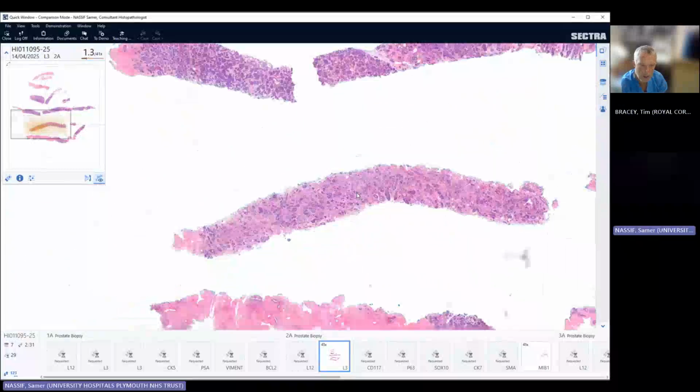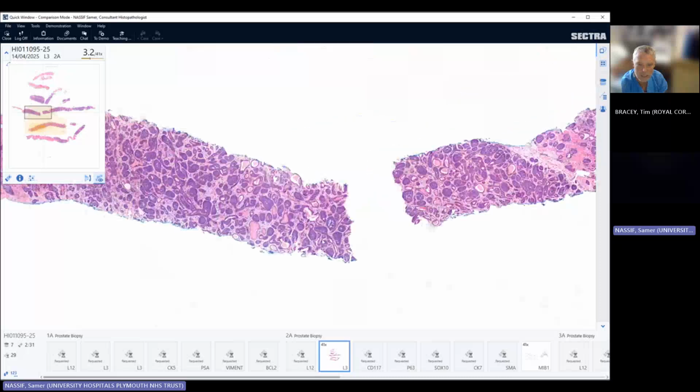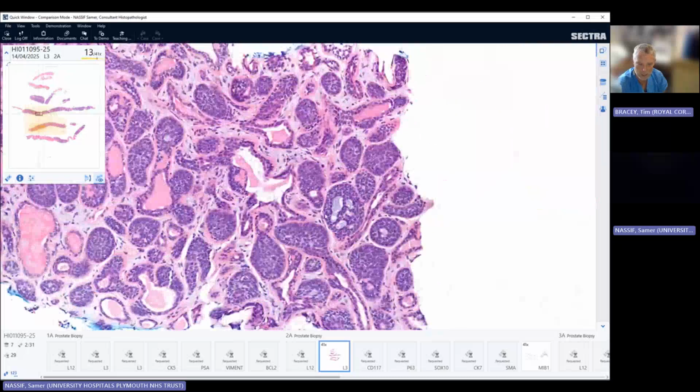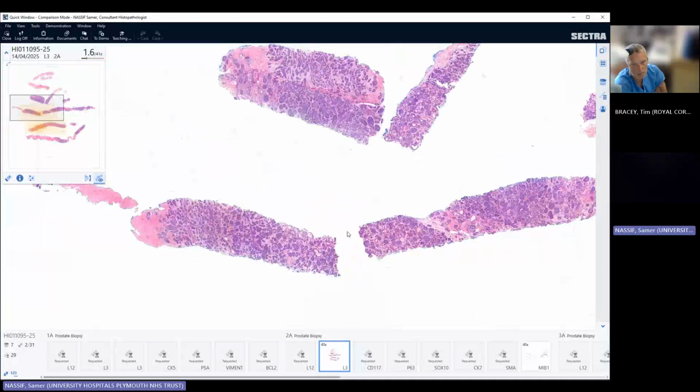Now in the prostate, I don't know about the salivary gland, but you'd see something like this in the anal canal, that's for sure. In the prostate, when they talk about the difference between the two, in adenoid cystic you would oftentimes have necrosis. It's infiltrative.